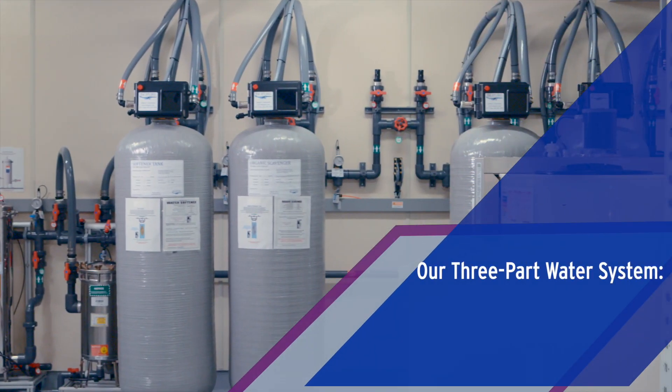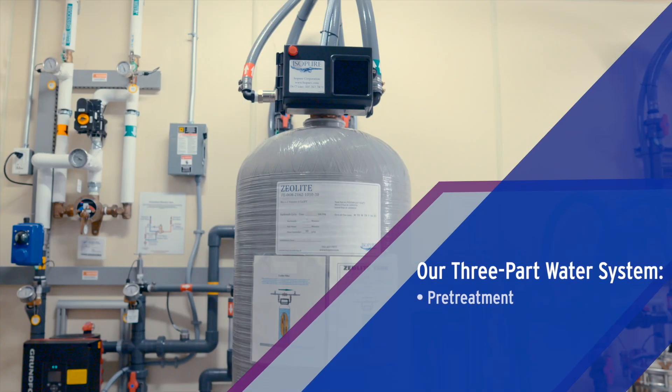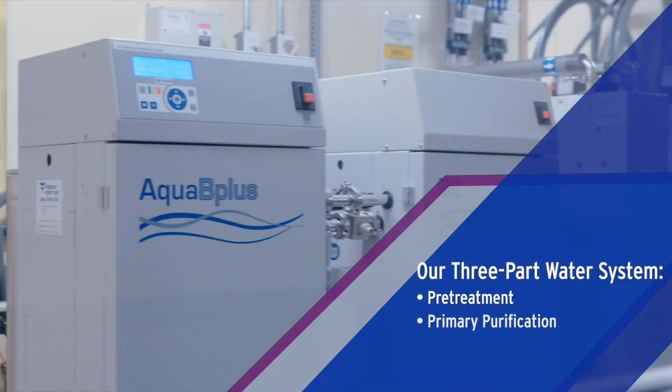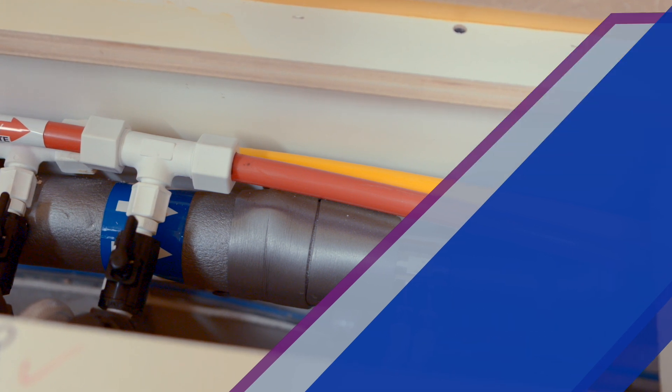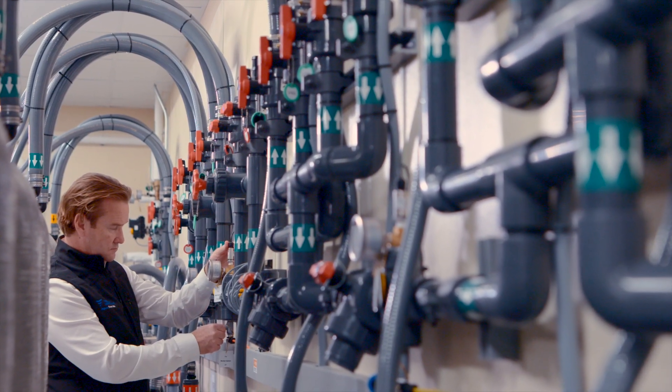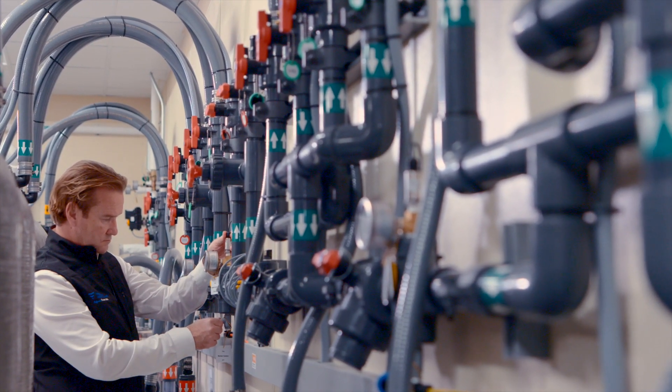This tour covers the three stations of our central water system including pre-treatment, primary purification, and delivery distribution on the clinic floor. And we'll finish with an important word about our full service approach for system integration into your clinic.